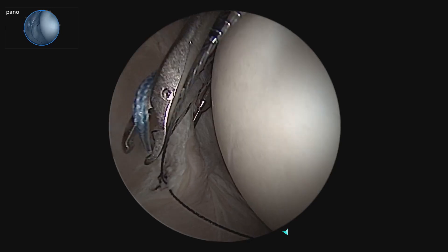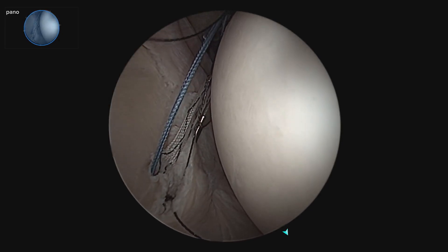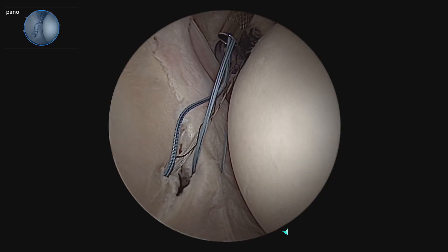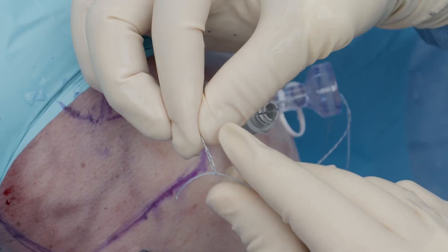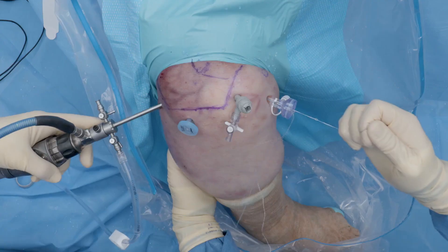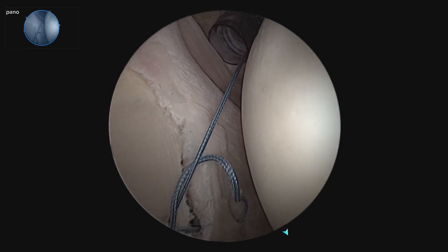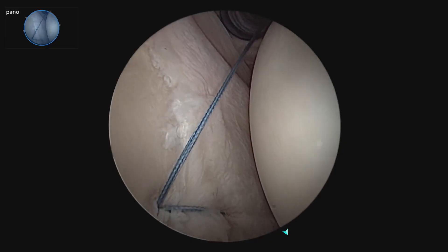Now we can retrieve with the nanograsper through the ASL portal the lasso and the repair stitch. We pass the suture back through the anchor using the loop and shuttle it through. At this point I will tension it but leave it slightly loose until final tensioning at the very end of the case.